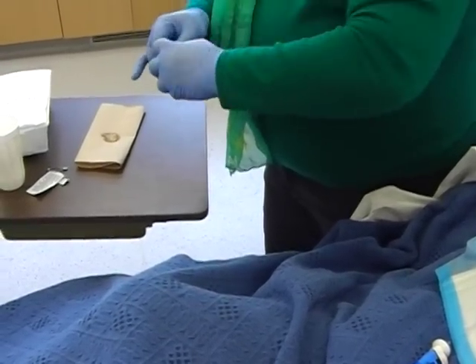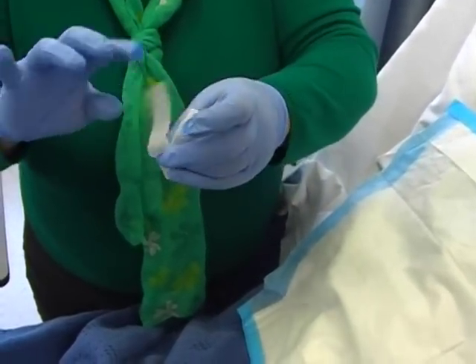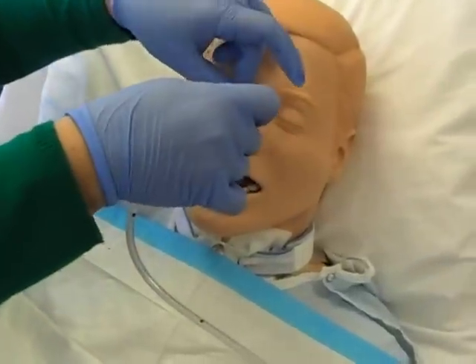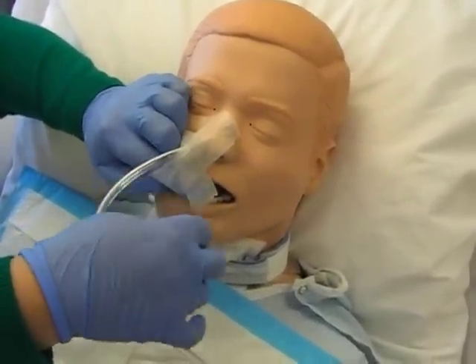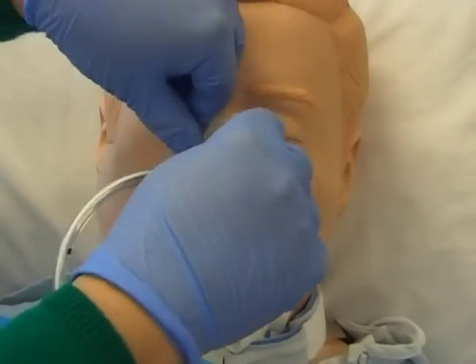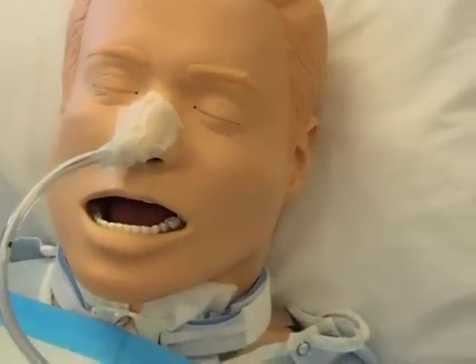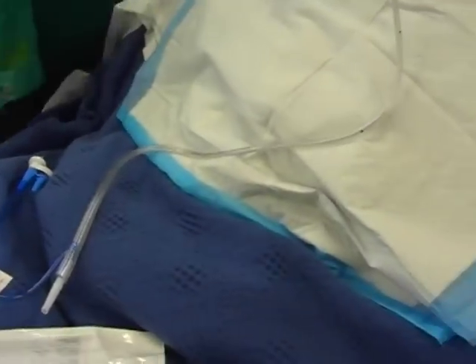Take a good piece of tape and tear it partway down the middle — not all the way. Place the uncut end on the bridge of the nose, then wrap the two split pieces around the NG tube and tape them up. This holds the NG tube securely in place so it won't move.